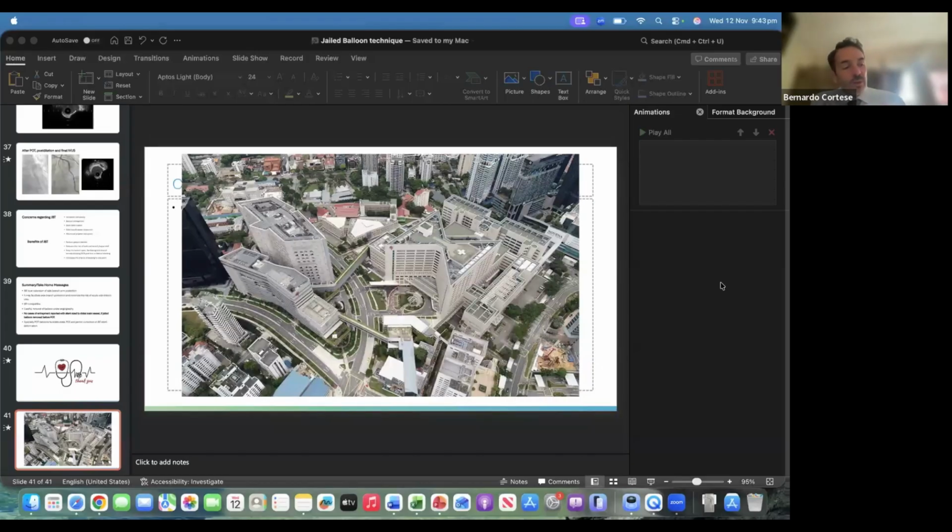And which is the wire that you prefer to use to recross? For me, I use the Asahi wires a lot. So we use Sion Blue, the Sion. No polymeric. Yeah, no polymeric. Sometimes, if it's a difficult cross, you might need to use a Sion Black. The other thing we tend to do is we have dual lumen. So we would put the dual lumen into the main vessel and then use the side port to try and cross over.